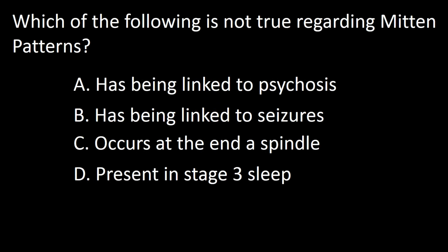Next question. Which of the following is not true regarding mitten patterns? A. Has been linked to psychosis. B. Has been linked to seizures. C. Occurs at the end of a spindle. D. Presents in stage 3 sleep.